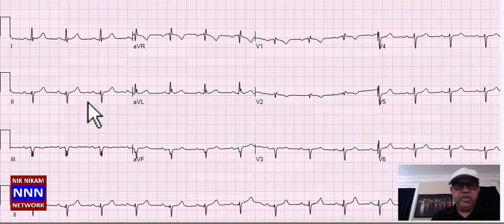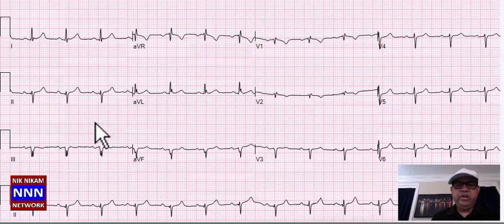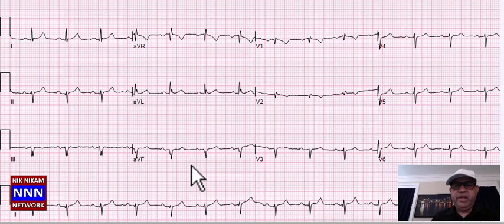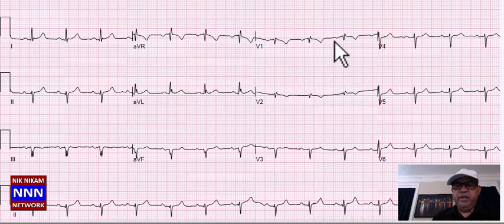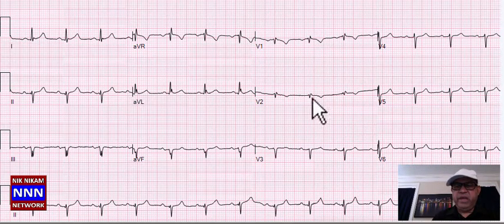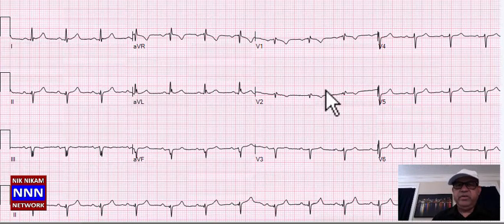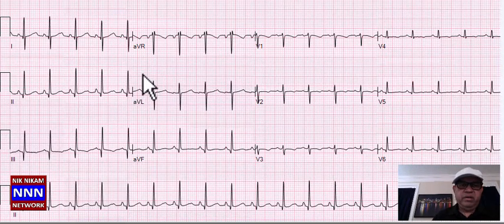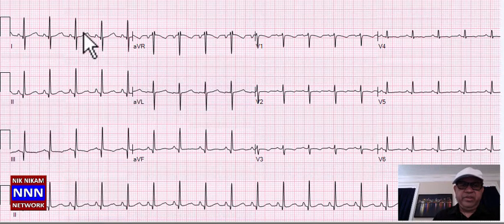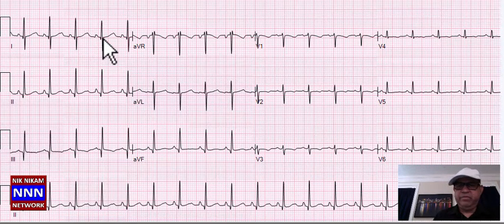Sinus rhythm, left axis deviation, left anterior hemiblock, incomplete right bundle branch block, possible old anteroseptal myocardial infarction — lots of interesting findings in this electrocardiogram.